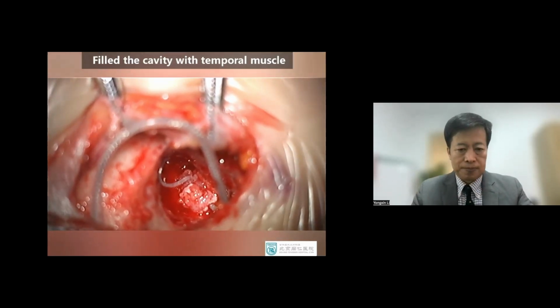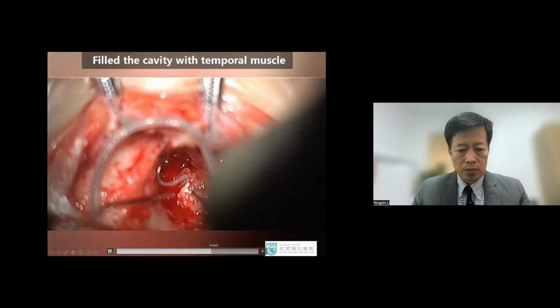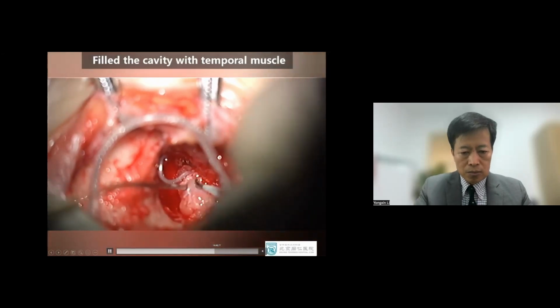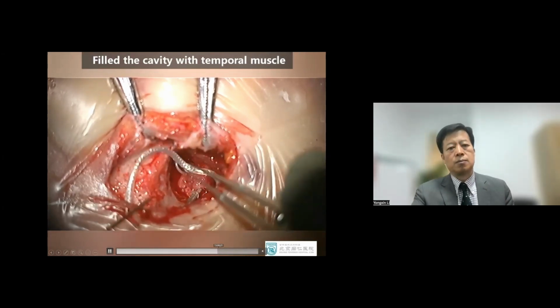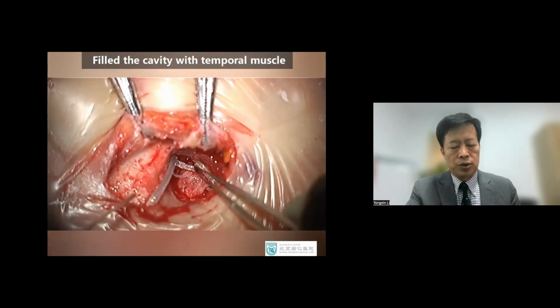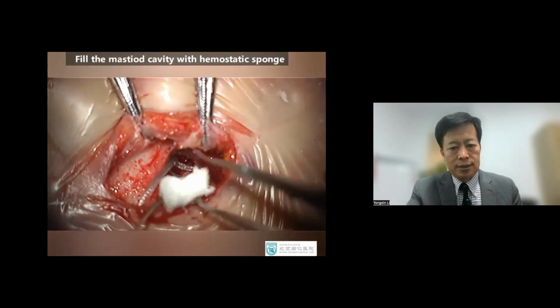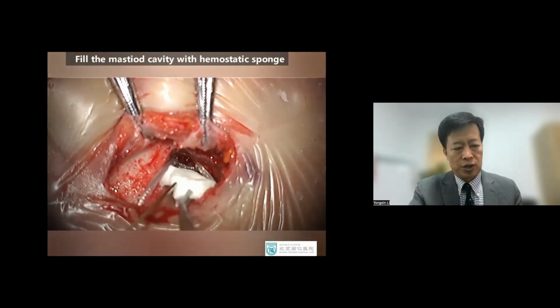So we stopped. So we try to locate the Y inside the mastoid. No tension.